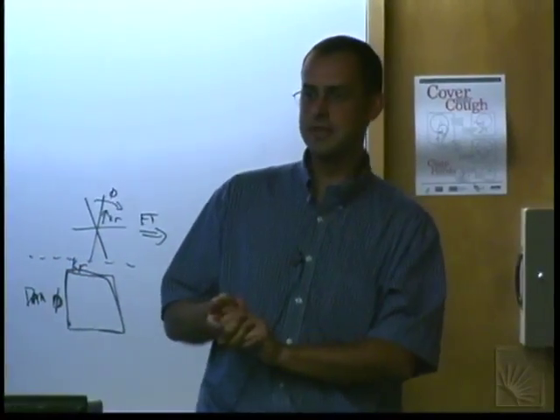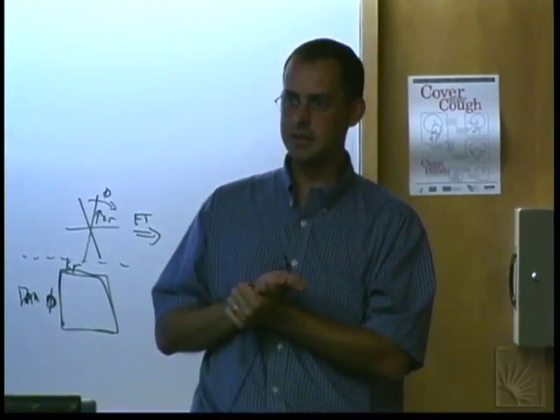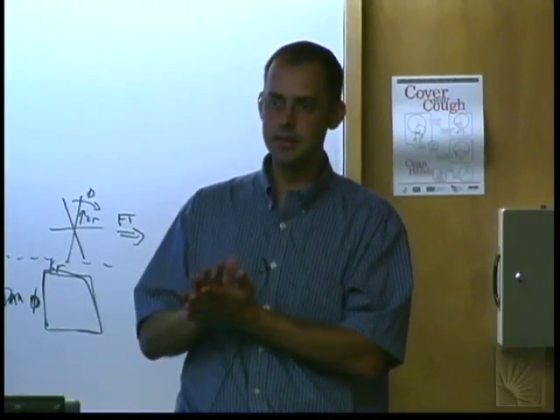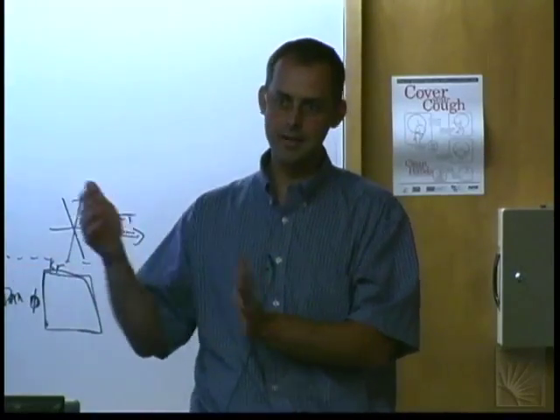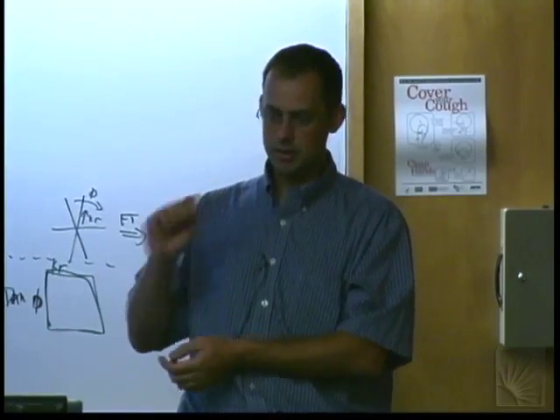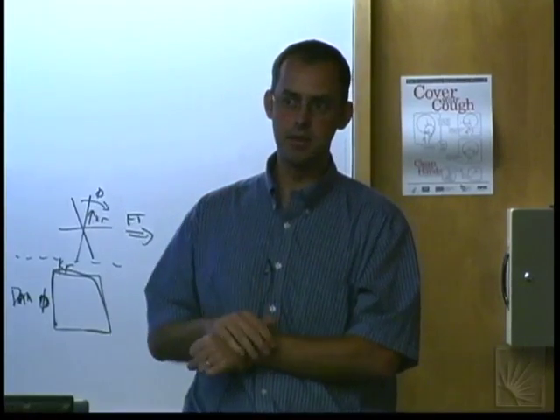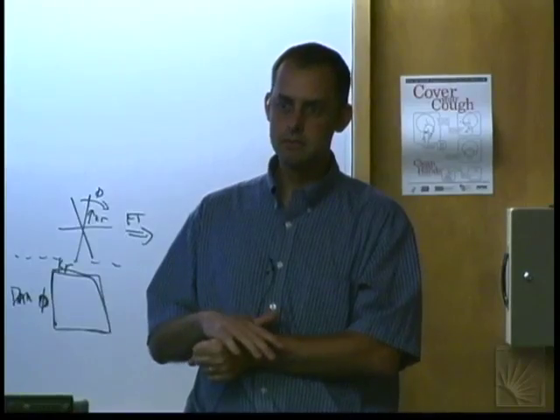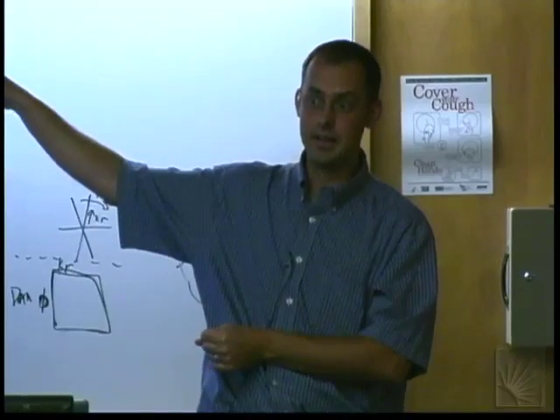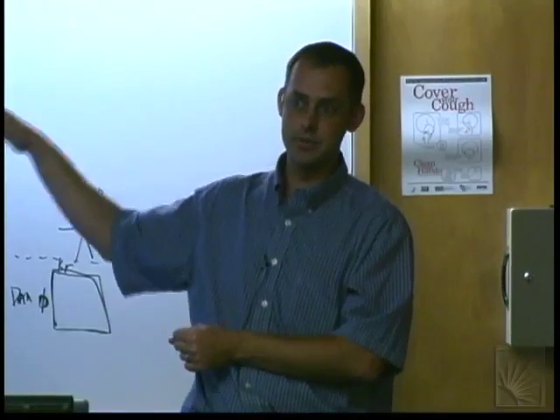This is a big limit in clinical MRI today. The FDA places a limit on heating, 1 degree per 1 gram per 1 minute, and that's solid. There's no getting around that. On the other hand, the more power we can deposit, the faster we can go, and the better the quality of the images. So when you get in that scanner, depending on the exam, you are going to be right at that FDA limit or right below it most of that scan. The efficiency argument is that if we have to dissipate all the extra power in the amp, which is not going to RF energy, that's when you start cooking people.